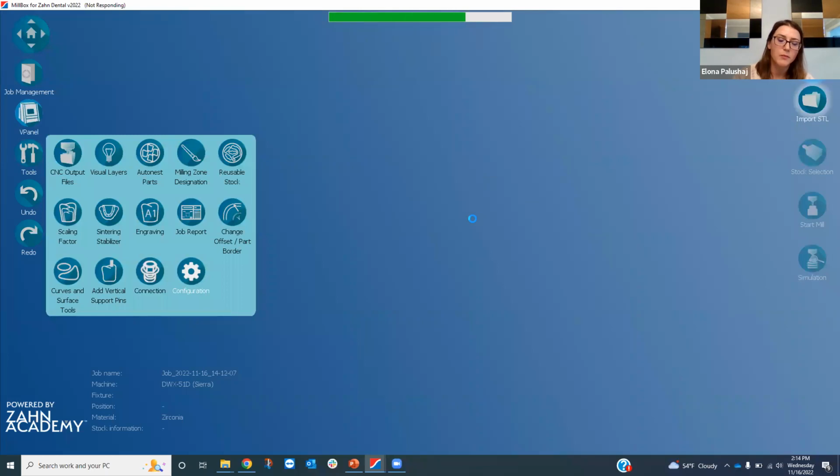And it's always best to consult your support team to try and figure out which option is best for you and how to configure it so that it works correctly from CAD to CAM. So that's the beauty of it. We support everything from start to finish, so we can assist with the entire process.